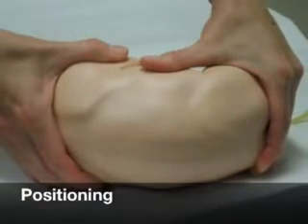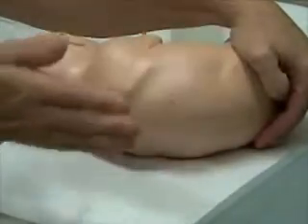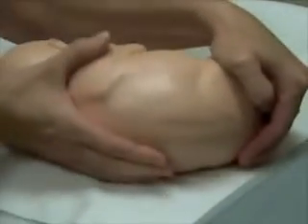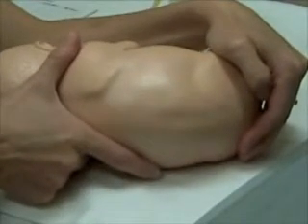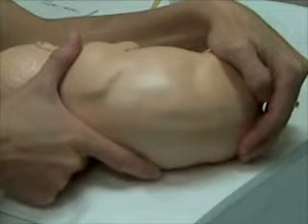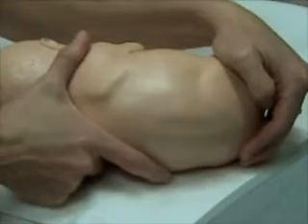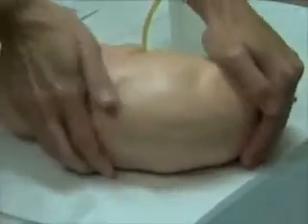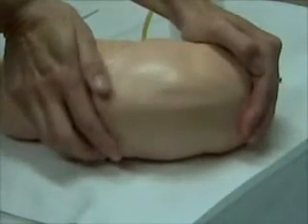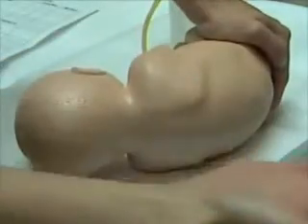Positioning of the infant is critical for a successful lumbar puncture. You need a good helper to position and hold the infant. Your assistant should be experienced and should respond to your feedback about positioning. The helper will hold the hips and shoulders, curling the child in a position to open up the interspinous processes. Infant lumbar punctures are typically not sedated, so the infant must be firmly held. Many helpers tend to curl the baby away from you, rolling their spine upwards. However, it is essential that the length of the baby's spinal cord is parallel to the table. Remember, the right alignment is critical.